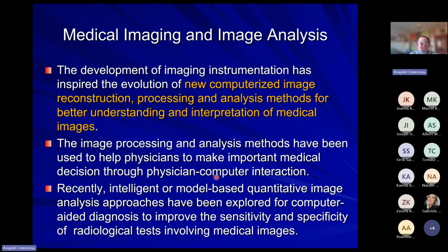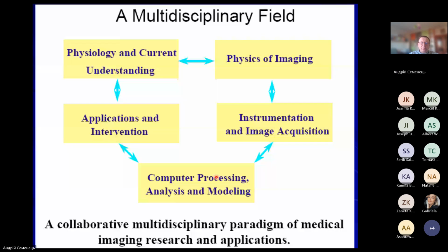At this point, I'm speaking about the second stage, which started with the development of digital computers after the Second World War, and which recently brought us to intelligent or model-based quantitative image analysis approaches, which have been explored for computer-aided diagnosis to improve sensitivity and specificity of radiological testing with medical images.